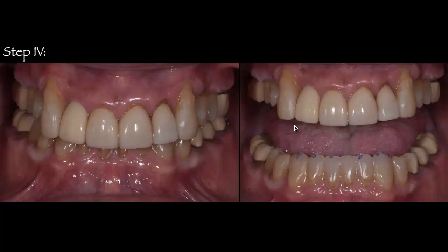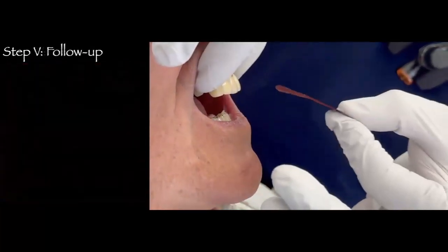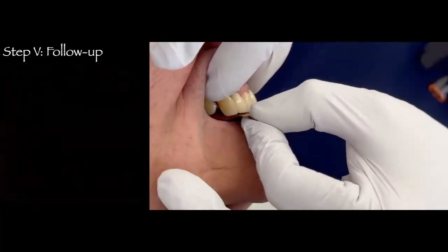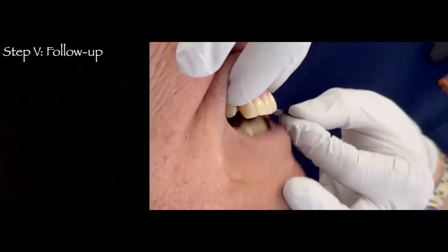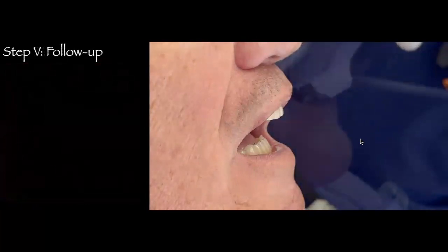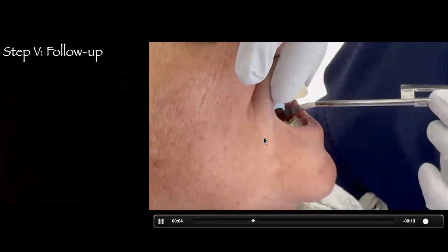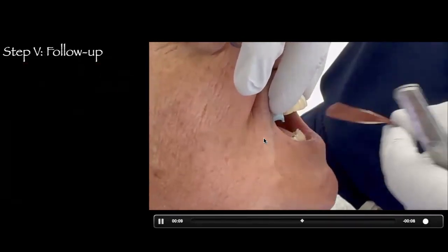Now all we have to do is wait and follow up on the cases, and that's what we're doing here. I want you to watch this video. I'm putting an articulating paper that has 12 microns, and you can see that I'm not able to pull it out. Patient has full contacts on all mandibular and maxillary incisors. But 15 days later, you can see that I have the bite registrations on the posterior teeth, and now I'm able to pull this paper out. There's very little drag.